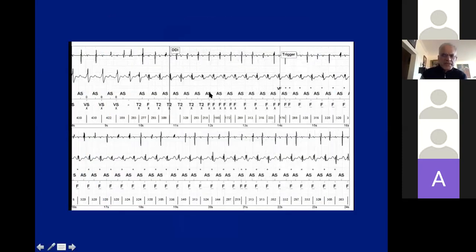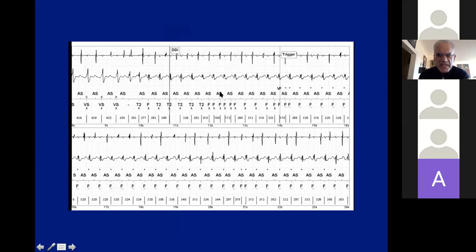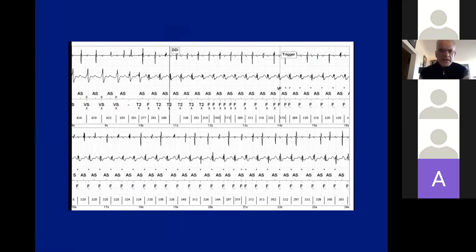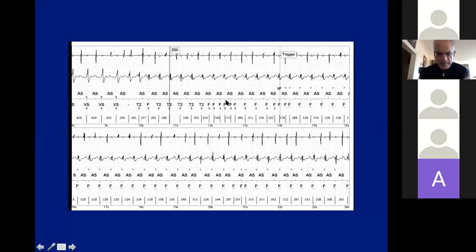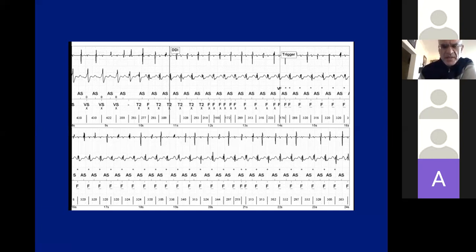The reason for the double counting is T-wave oversensing — the device is seeing the T-waves. If there is one thing you take from this lecture, always look at the markers — always look at what the device is thinking. This marker corresponds to the T-wave, this marker corresponds to the QRS. The device is double counting. So the device thought this was VF, but this is actually SVT, as demonstrated by using the additional criteria from dual-chamber electrograms.